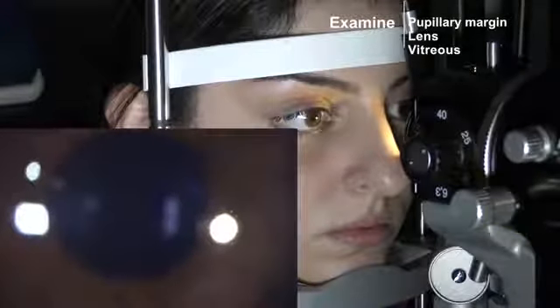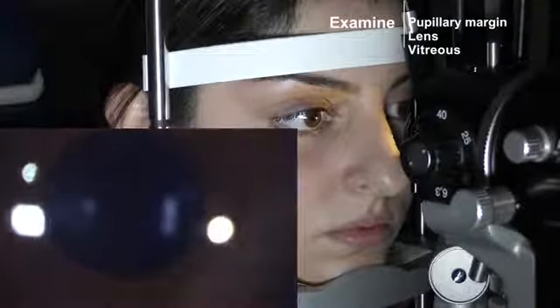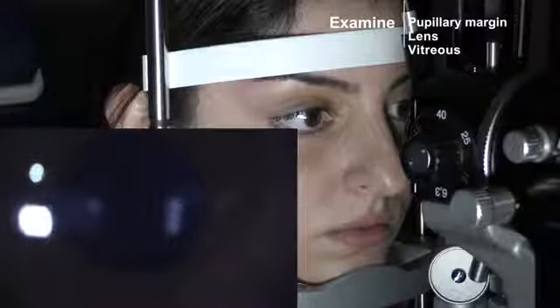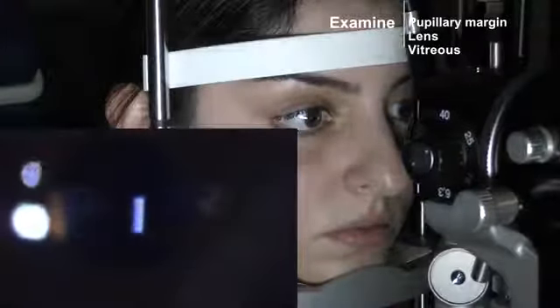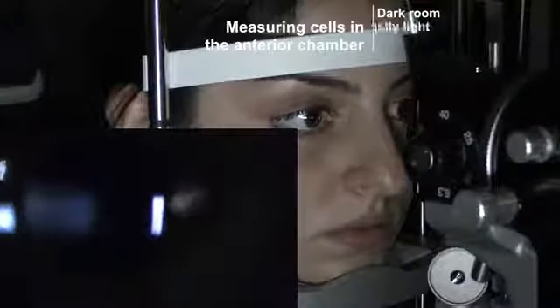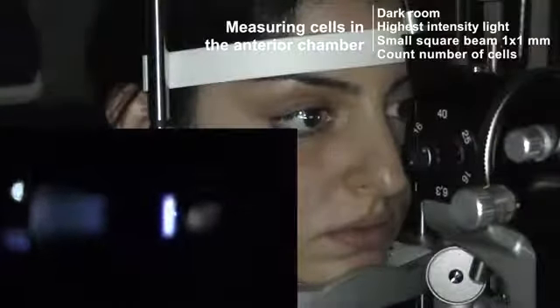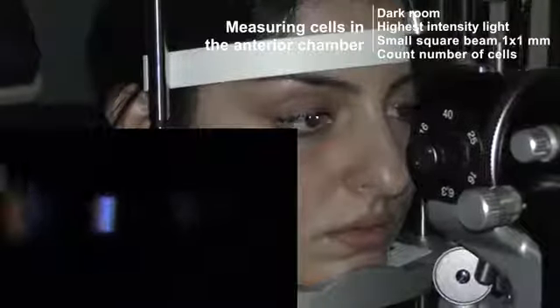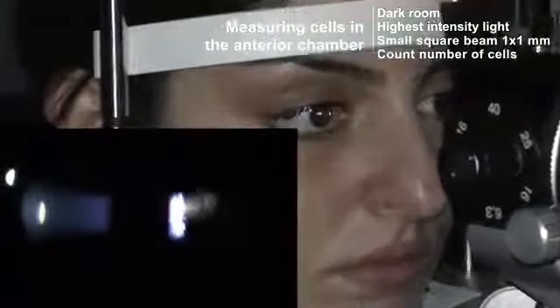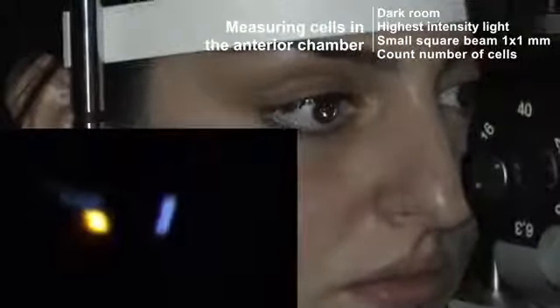I'm going to decrease the light intensity in the background, and then increase the light intensity on the beam. Look at that, unbelievable. So there we go, we have a beautiful section through the pupil. The reason we shine it over the pupil is because we want a nice contrast. We want a black background to look for cells. So here is the pupil margin.